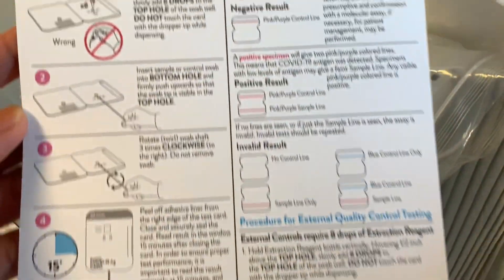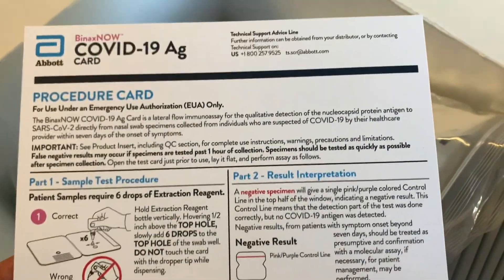And if you ever forget the steps, you can always refer to the instructions that came in the box. It is very straightforward and easy to follow.